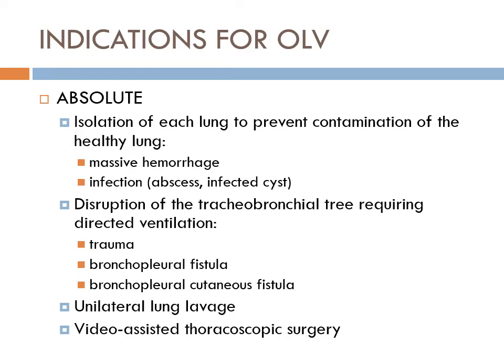And we know that this is, first of all, is this a left or right double lumen tube? Easy answer. It's a left, because it's in the left mainstem bronchus. This tube's designed to go left. This cuff is even more important for ischemic damage to the surrounding tissue. So manometer and pressures are also important.